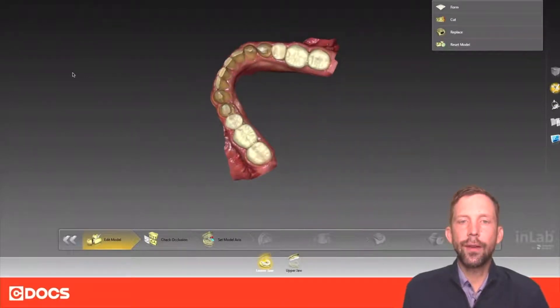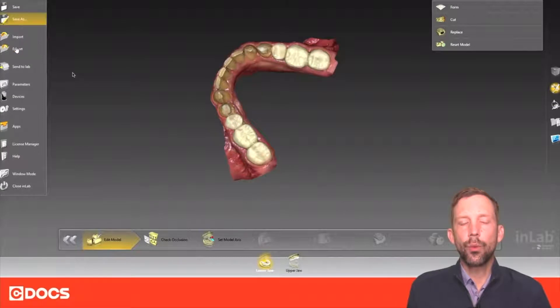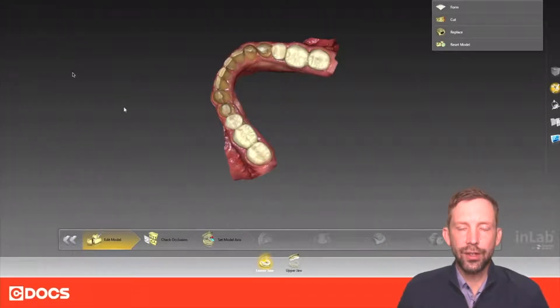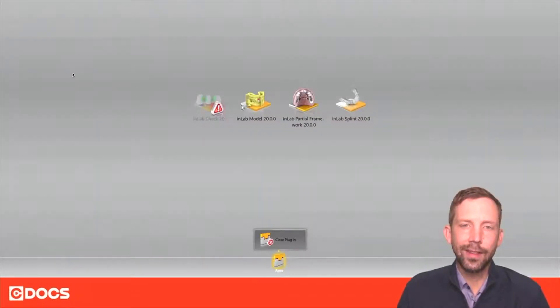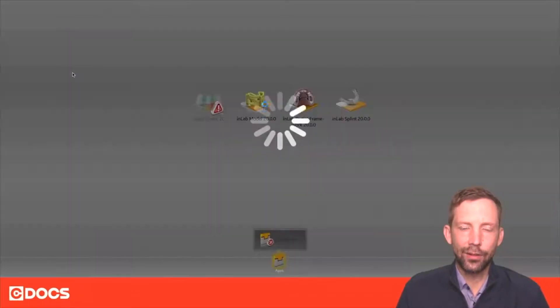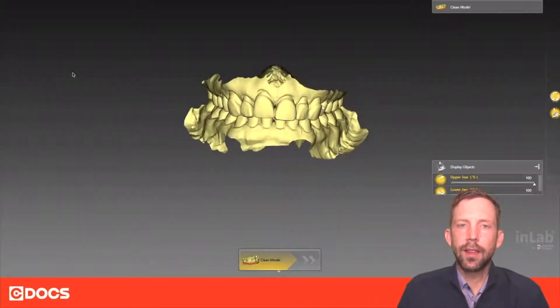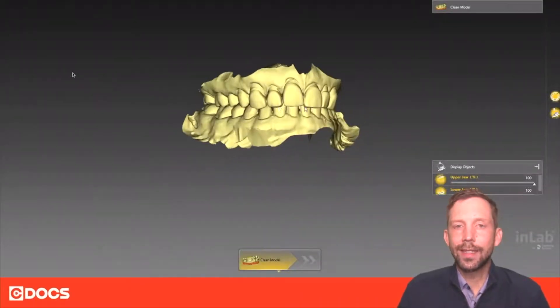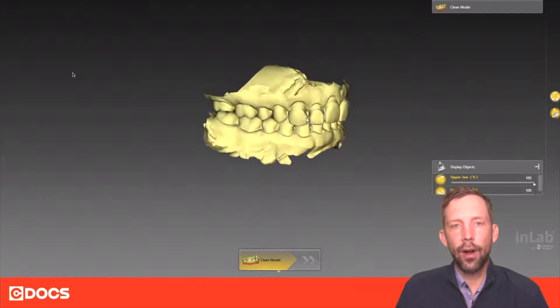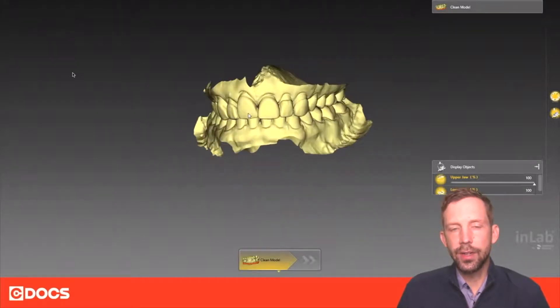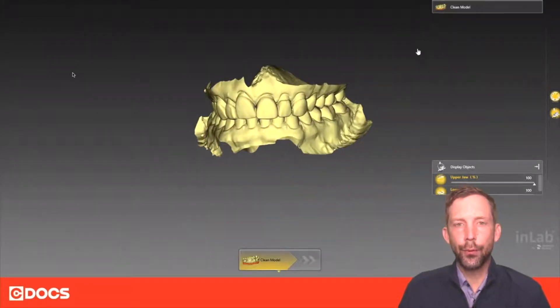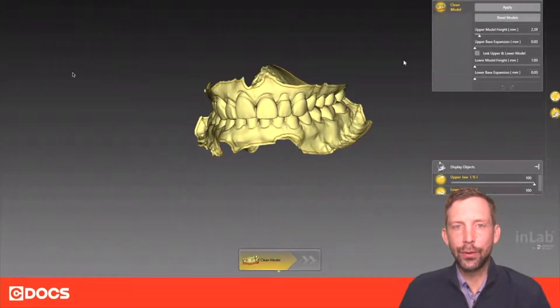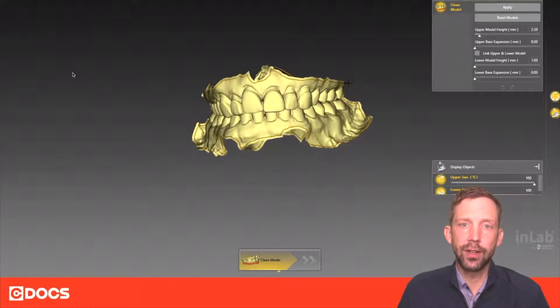Once you have these in here we can go ahead and open the application of Model Maker and bring these into the model software. Once they get into the model software you'll see there's a step-by-step process that you need to complete. You can't move forward until you clean the models.